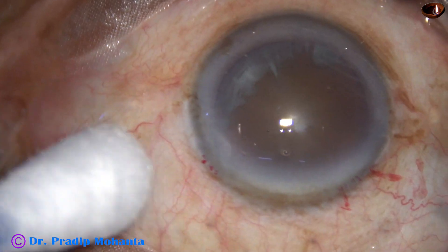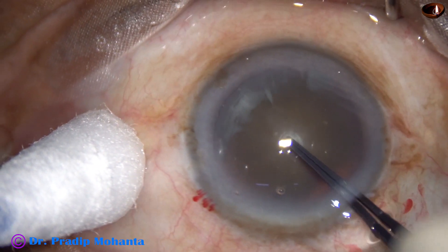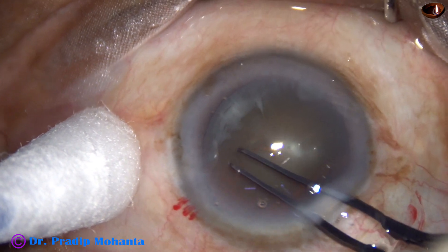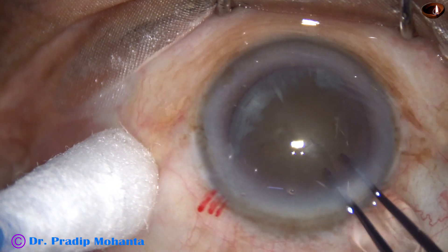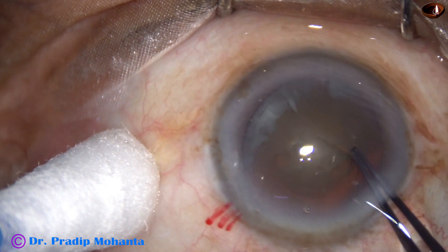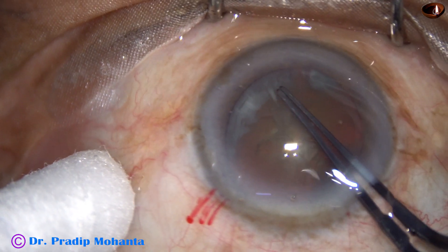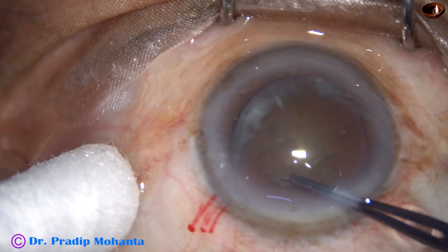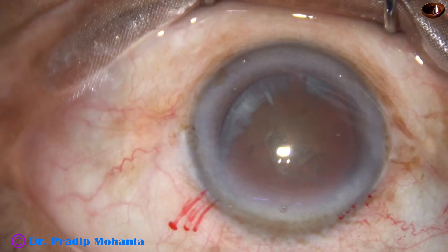Now capsulorhexis. Capsulorhexis is done with a Utrata forceps. A capsular tag is raised and this capsular tag is guided anti-clockwise all around. This is a hard cataract, so the size of the rhexis is more than 5.5 millimeter — 5.5 to 6 millimeter.